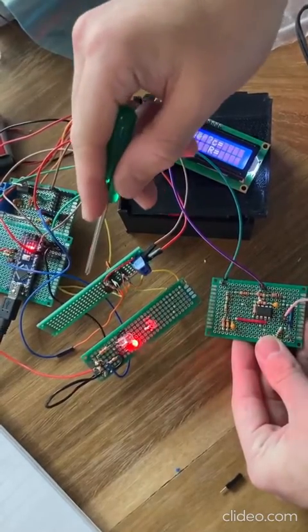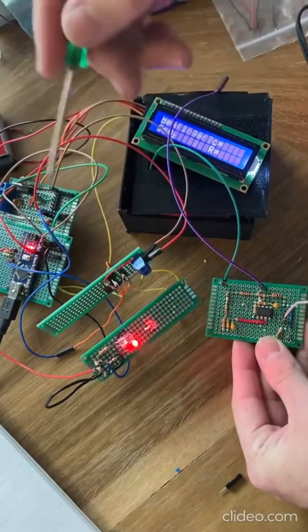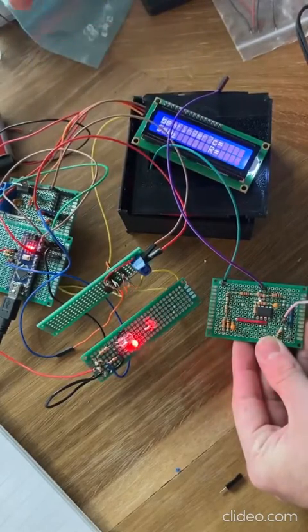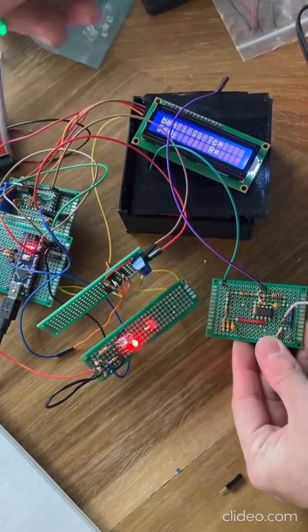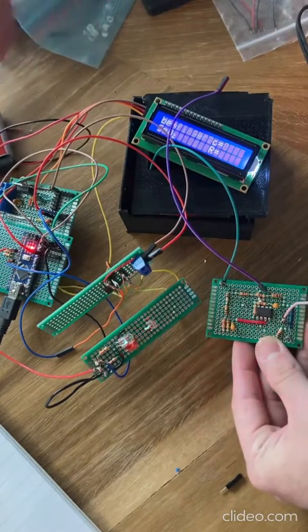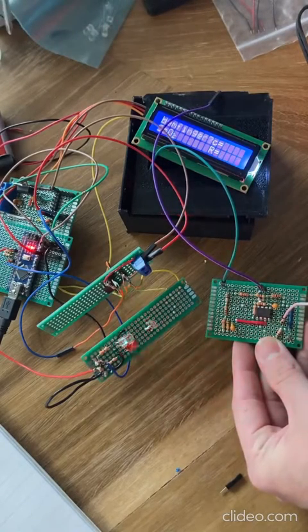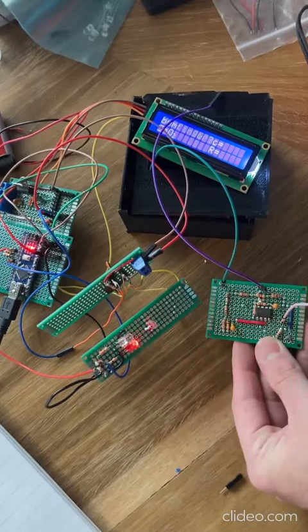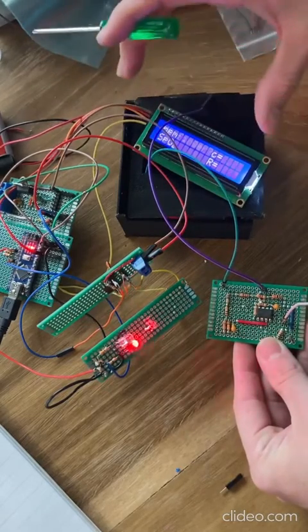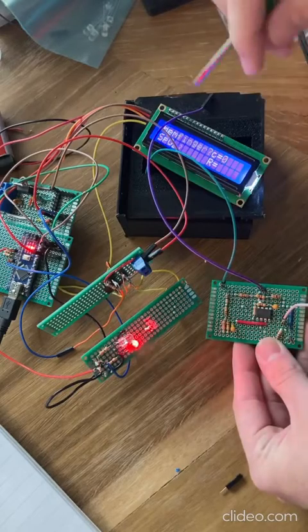However, the signal from the TI amplifier is pretty noisy. So whenever we get the beats per minute, heartbeats per minute, and the oxygen concentration, it is a little bit noisy and not as accurate. I mean, it's accurate, but there's just some issues with the sampling. As you can see here, where it's jumping through different values and keeps going no finger on the display.